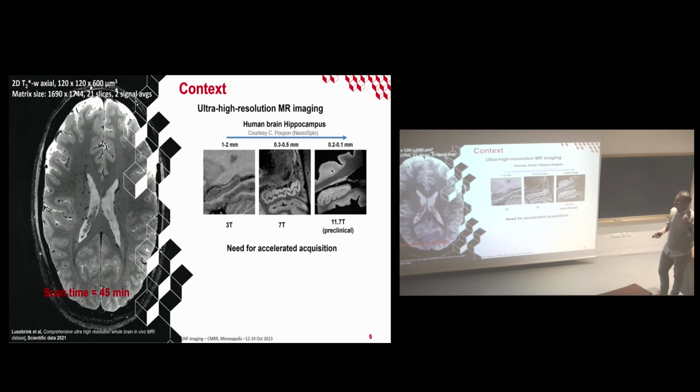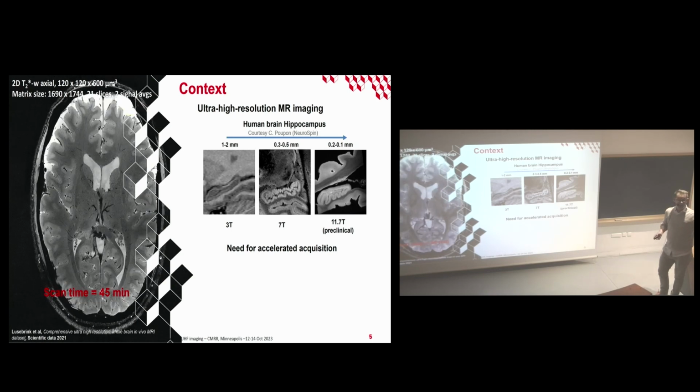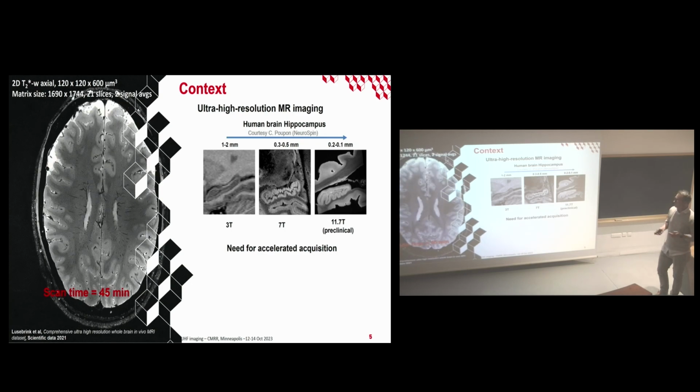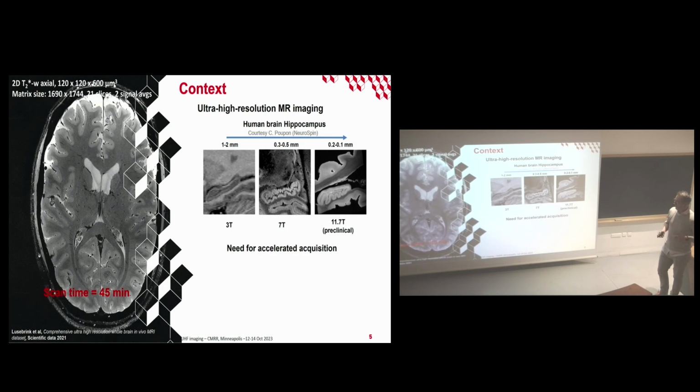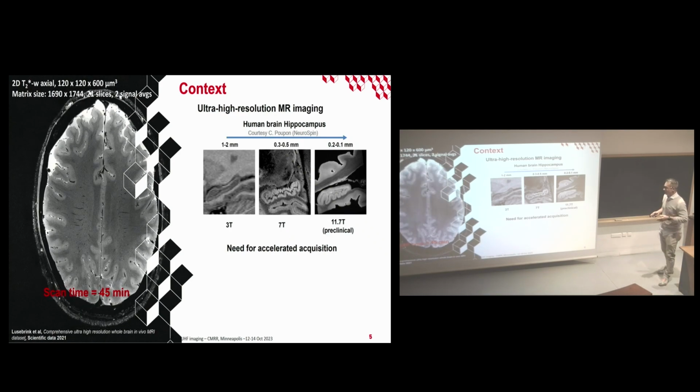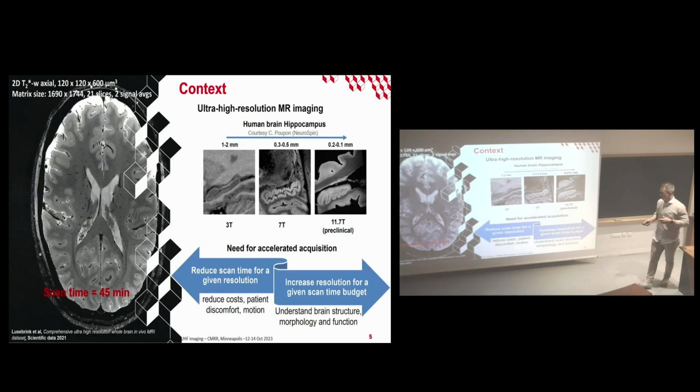And of course, there is also the question of handling motion, so how to correct and mitigate the motion, which induces blurring artifacts. So we need techniques to accelerate, to speed up the acquisitions.